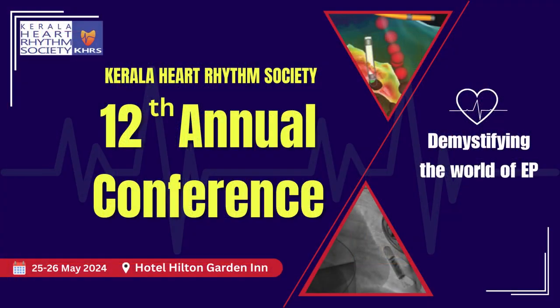Yeah, so His bundle pacing is very clear when we have QRS narrowing. With left bundle branch pacing, I don't believe in QRS width as a guide.